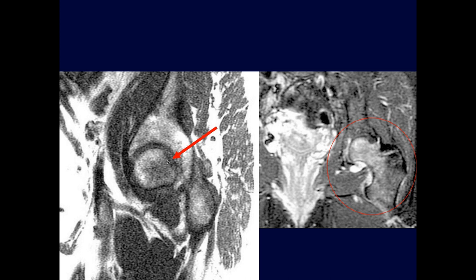Can you get like a transient osteoporosis? So what is transient osteoporosis? Well, it's just marrow edema basically, right? Or transient osteoporosis is a plain film diagnosis, not an MR diagnosis. Okay. So what do you see on a plain film? Well, you just see less dense bone. You see osteopenia. Yeah.